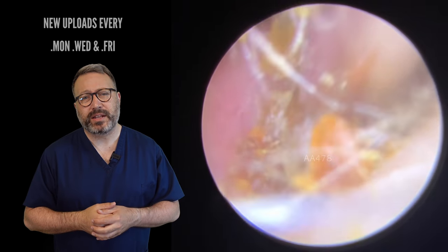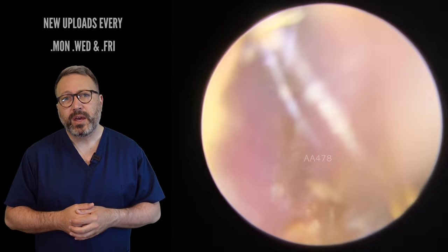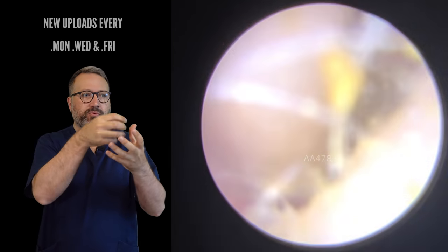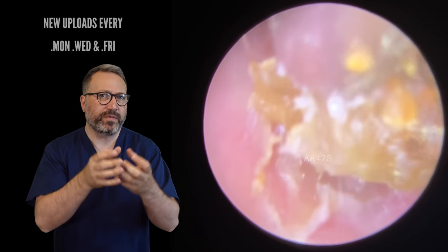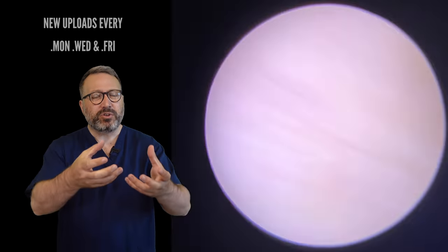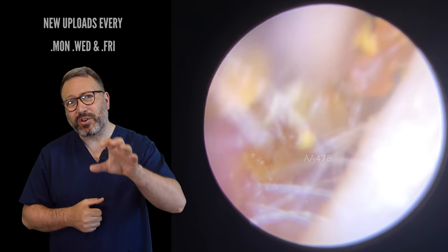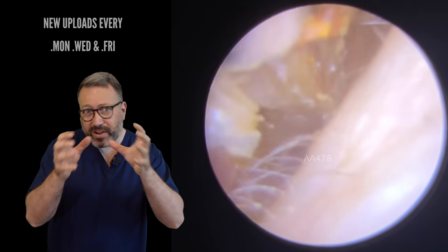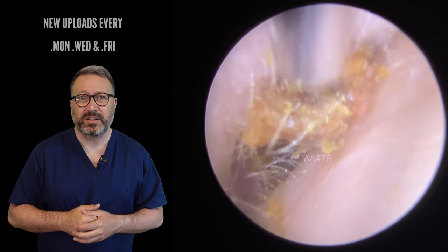We're now using the standard size Zolnir tube here. It's not an ideal type of wax to take away with the Zolnir tube because it is so hardened up on the outside edge — it holds together really well around the outside edge and sometimes you'll break little bits off in the centre. The standard size Zolnir tube does great for harder wax that's slightly softer on the surface. But for this super sticky wax with a hardened outside edge, you just don't get enough force with the suction to hold on to it tight enough to draw it out of the ear canal.